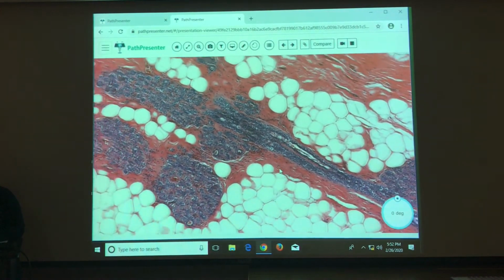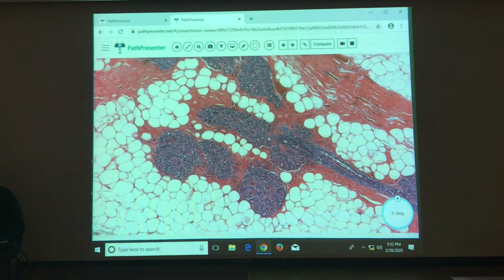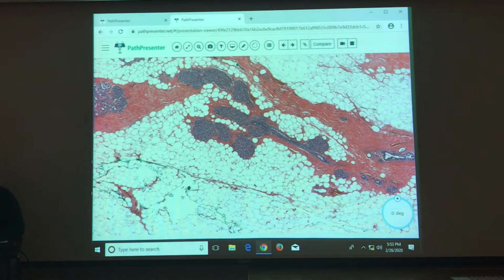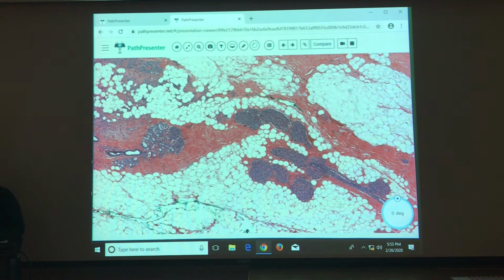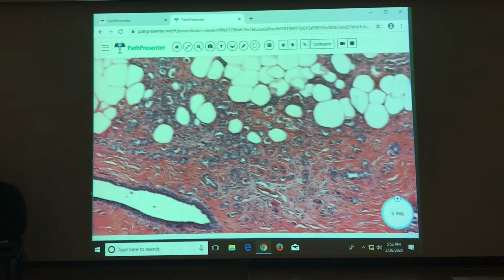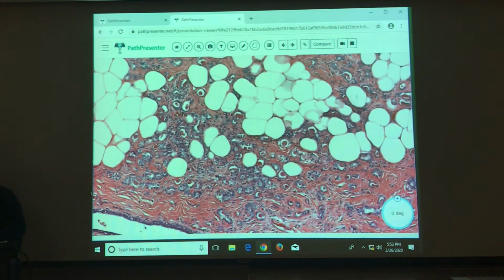They're not really forming. Maybe it's the cut, but it could be a terminal lobule here, but I don't know. It looks kind of funny, the shape, the architecture. Over here, oh yes, this one's better. There are eosinophilic secretions in the center of these.